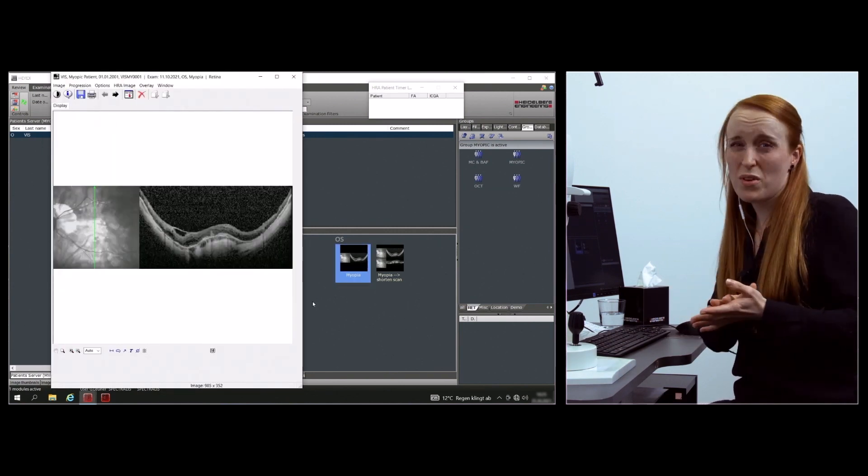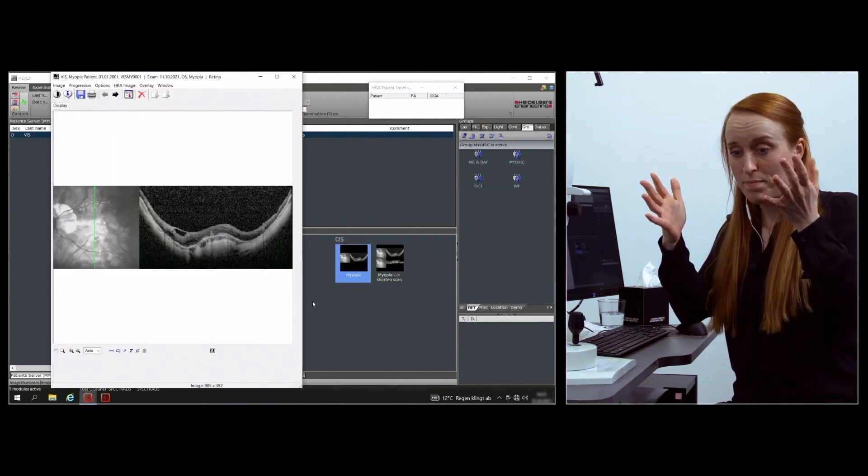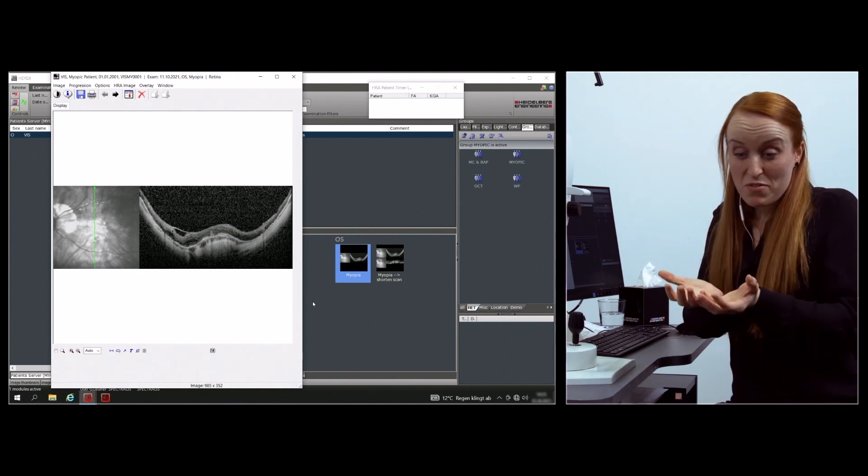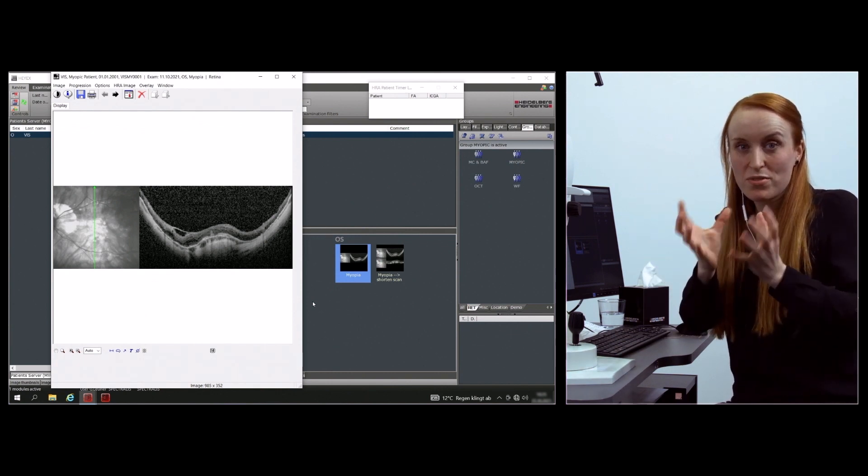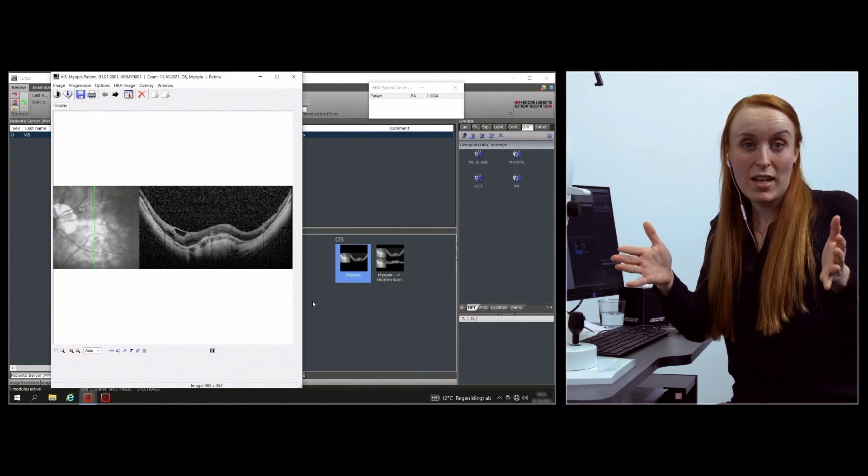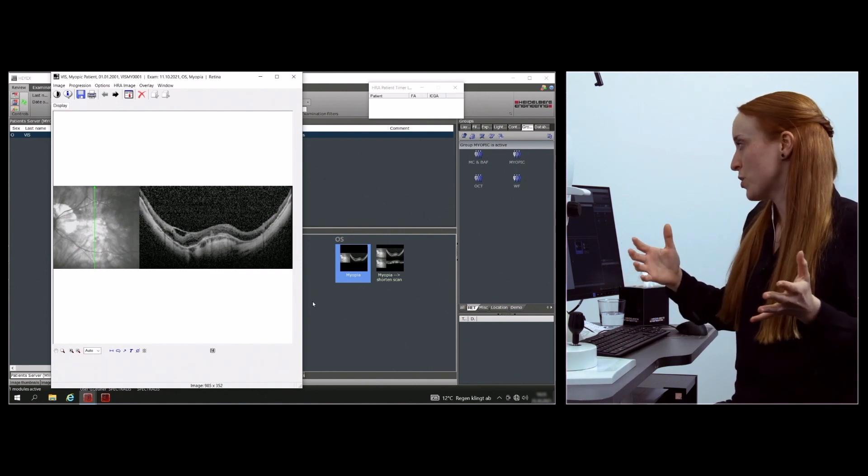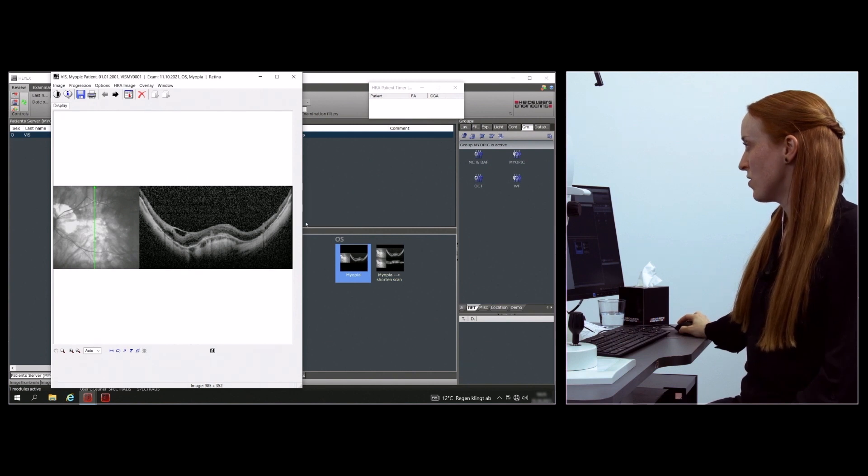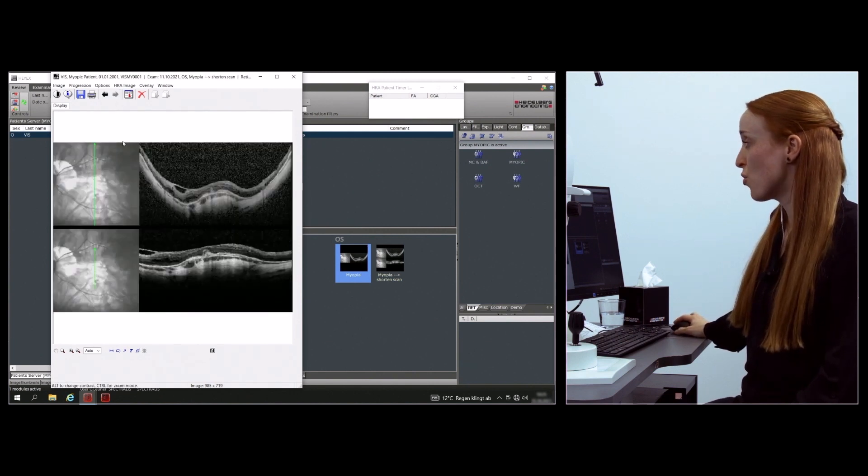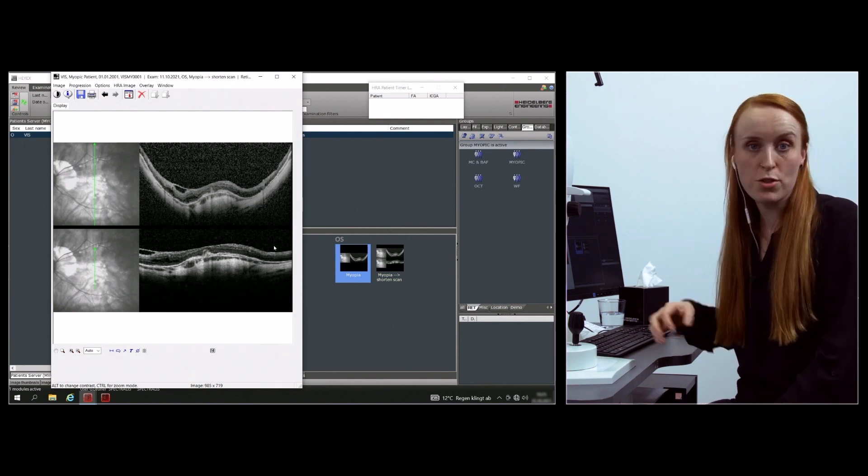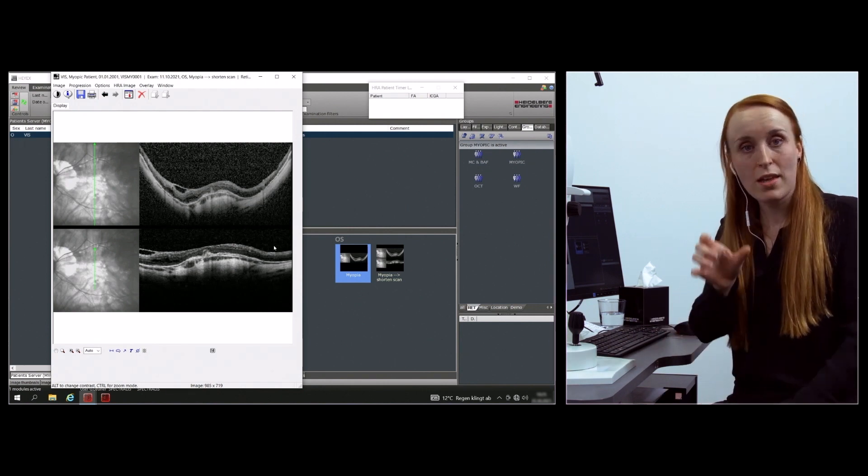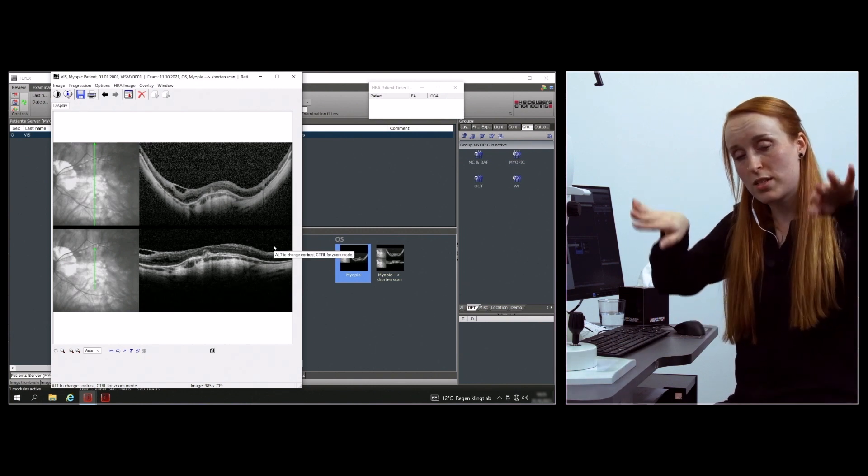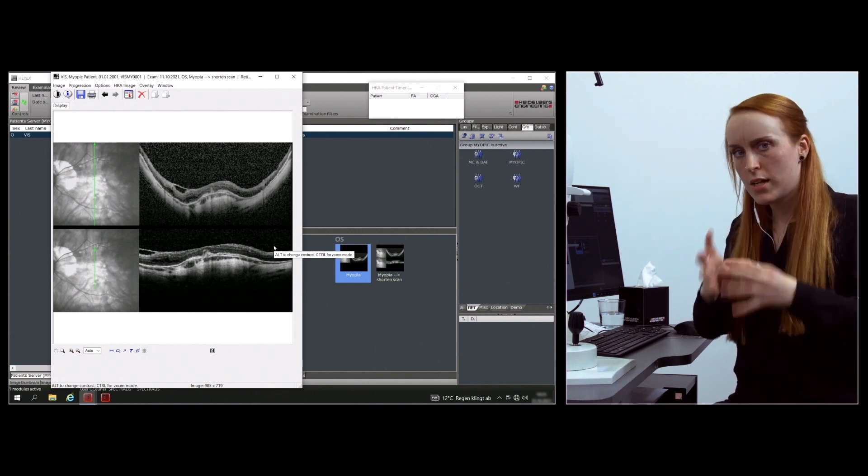What else can happen in myopic patients is you have this really spheric shape in the scan length you're using. What you can do is avoid imaging this area and just shorten your scan to get the focus on the information that matters for the patient in that moment without having it that tilted.